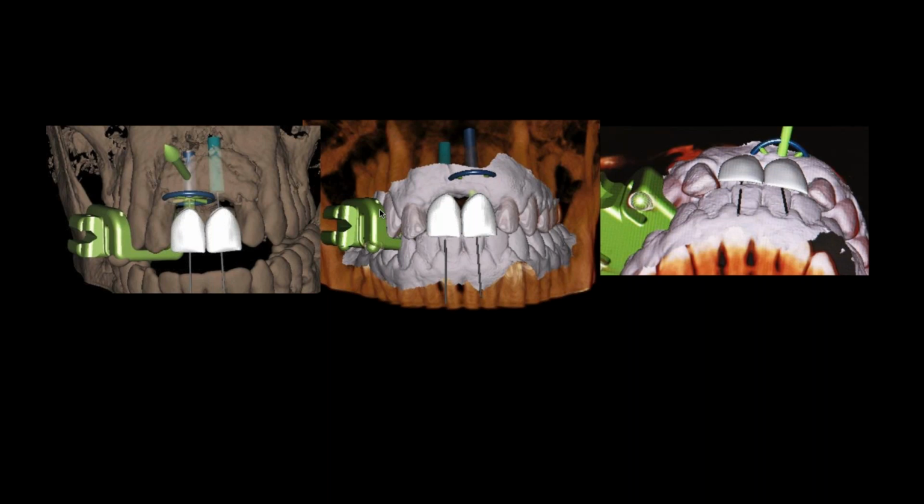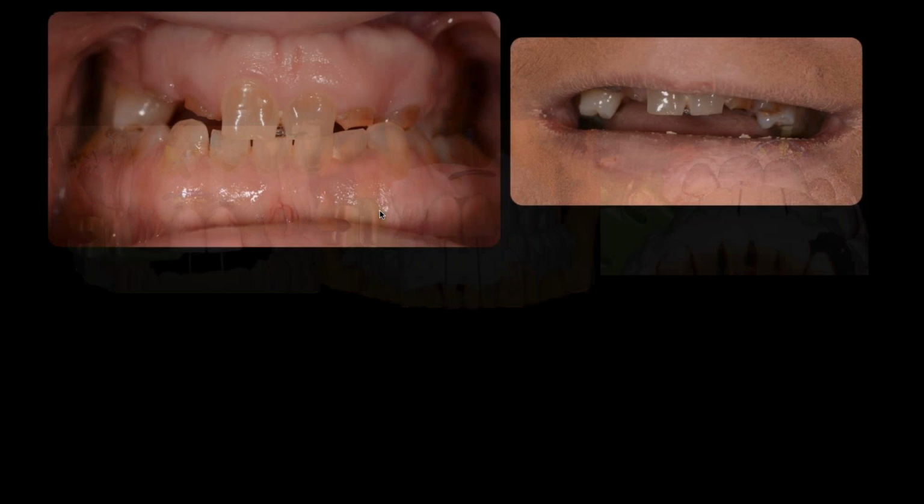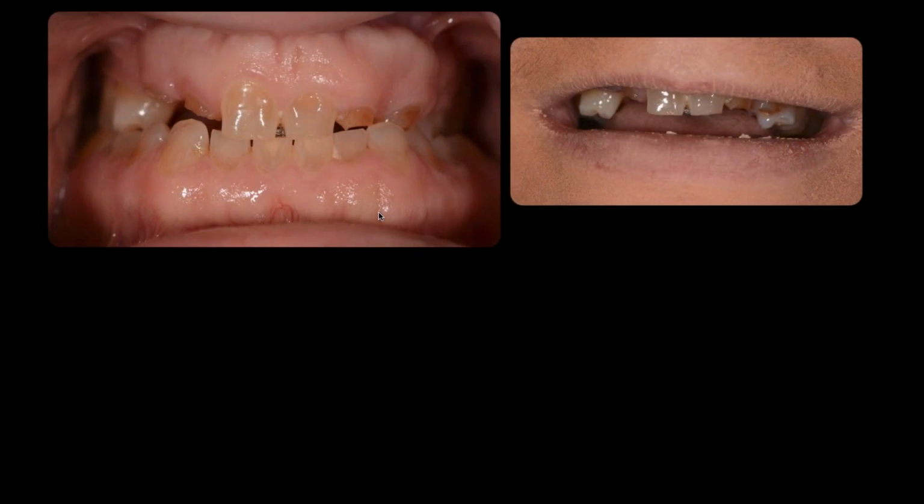And this really is important because the patient sees the expectation. And then when he doesn't have papillae, he's okay with it. It's all right for him. And now this woman here, I just got a couple of cases, and then we'll take some questions. This woman here comes in.